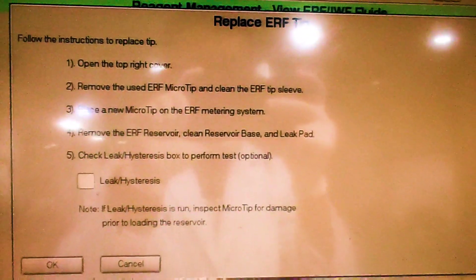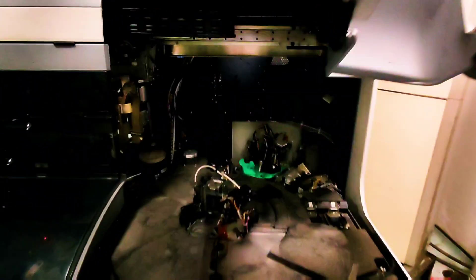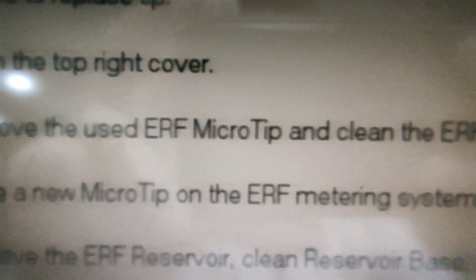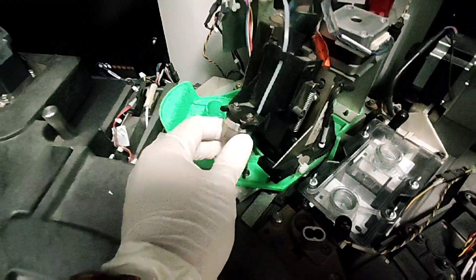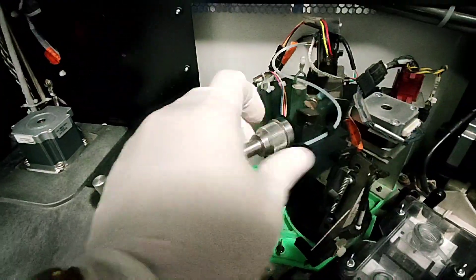First, it says to open the top right cover, so we will do it according to what it says. Secondly, it says to remove the used ERF microtip and clean the ERF tip sleeve. Now we will pull the tip sleeve upward and place a new microtip on the ERF metering system.